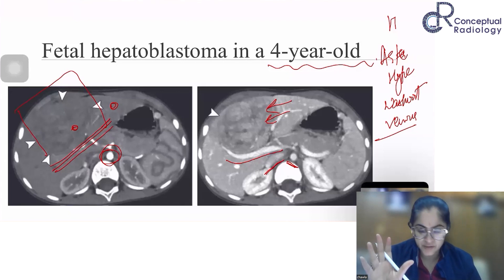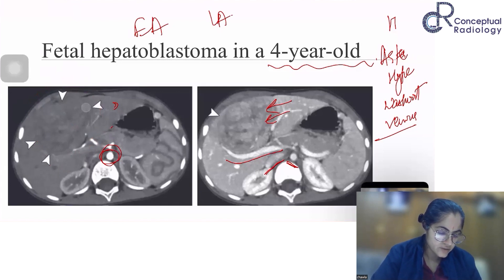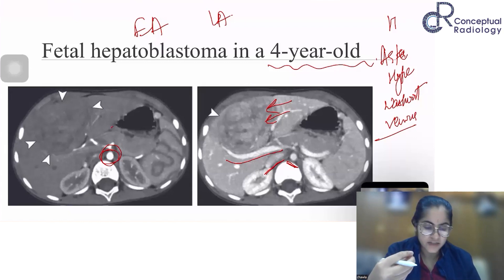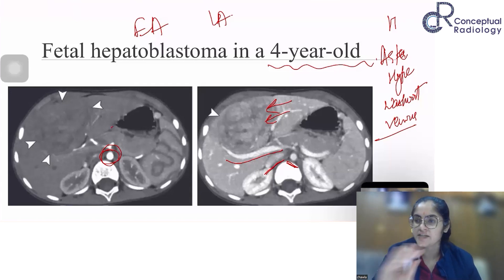This is why the distinction between early and late arterial phase matters. This particular arterial phase image is not showing arterial phase enhancement because it is an early arterial phase — an angiogram-like picture where only arteries are opacified and contrast has not yet reached the supplied tissue. To see true arterial phase enhancement, instruct your technicians to acquire the late arterial phase at 35 seconds. The portal or hepatic venous phase washout is easy to see — the lesion simply appears less enhancing than adjacent liver.